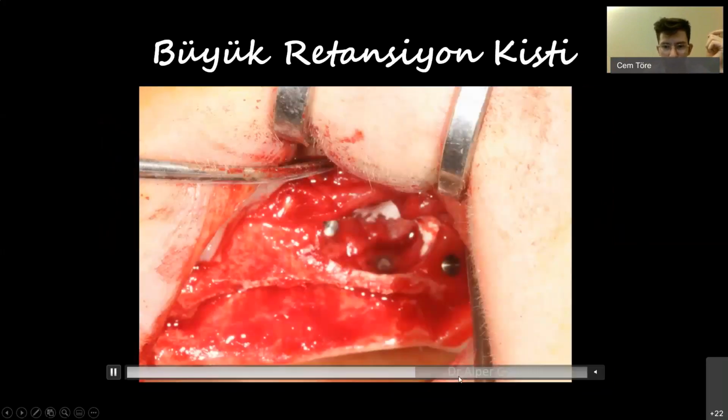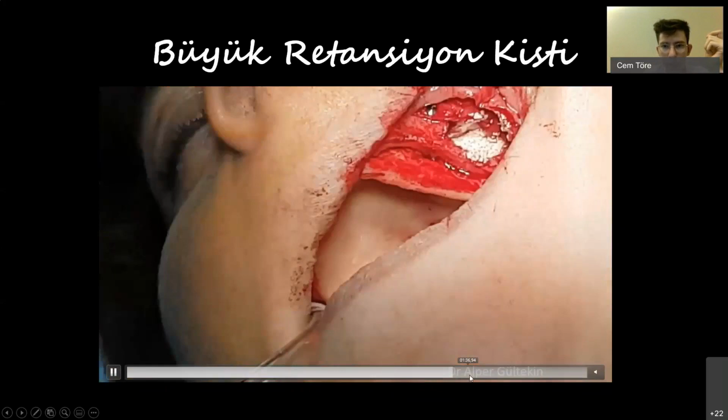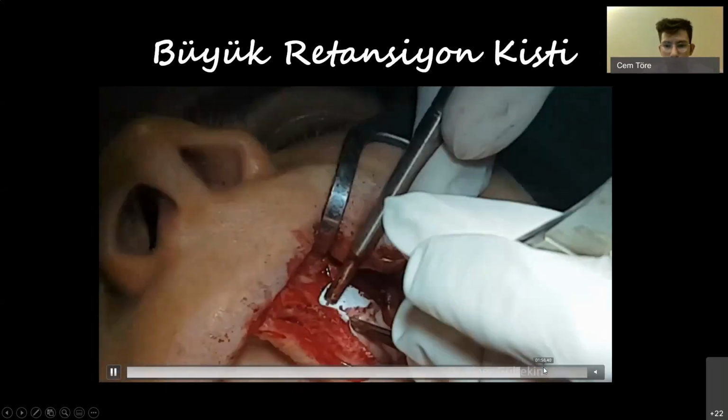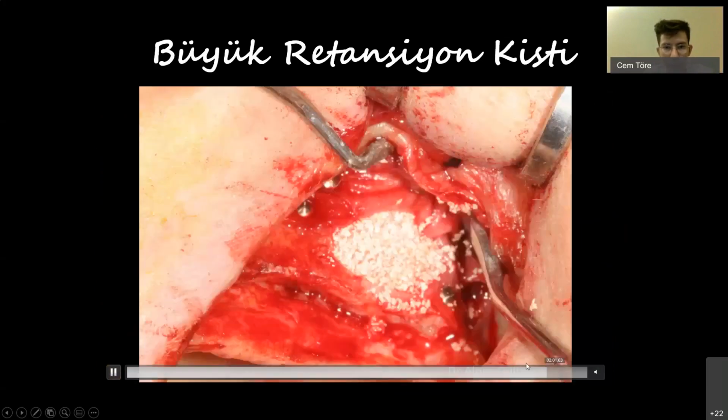I will take questions in a while. We are coming to the end. We have pinned it in place, two pins inside, our new Schneiderian membrane, as I mentioned. We graft the place, we graft the sinus, and close it with another collagen membrane. Just two pins is enough afterwards.